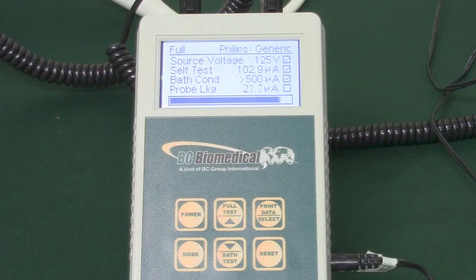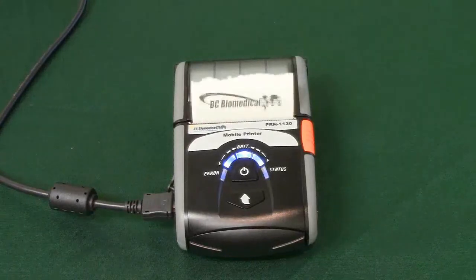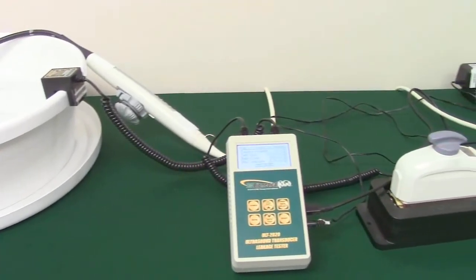When finished, PASS or FAIL will appear on the screen, indicating your results. If a printer is attached, the results will print off in detail along with a PASS or FAIL. Repeat this process for all ultrasound transducers.